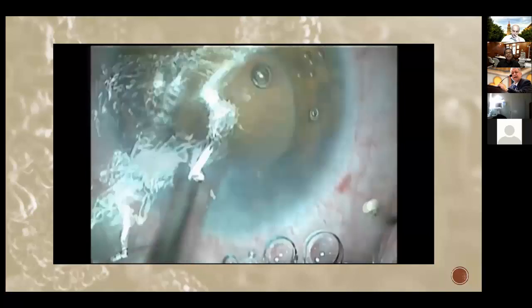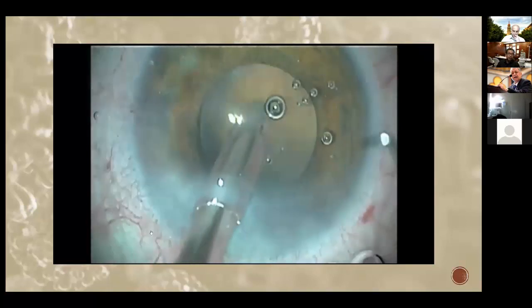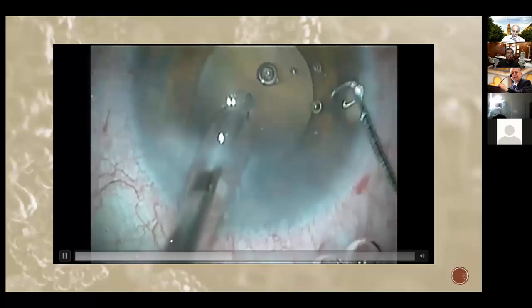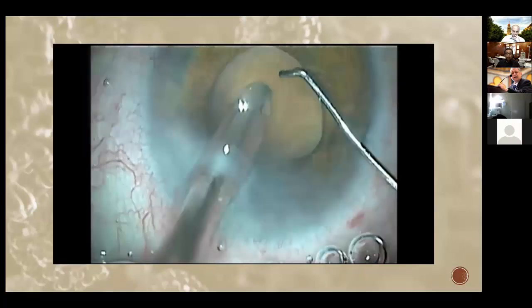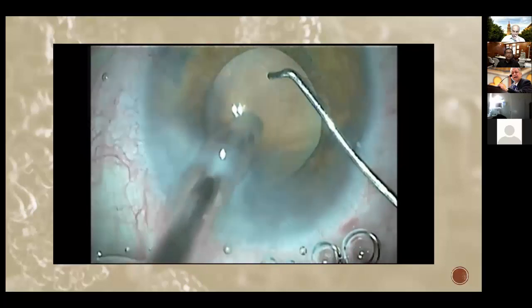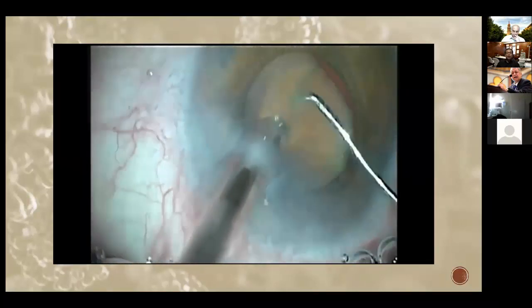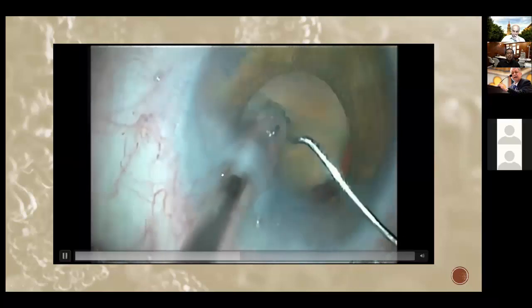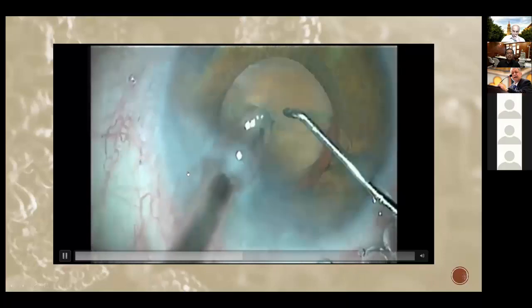Now my settings are going to change from a normal hard phaco case. What I will do is horizontal chopping, or transverse chopping, but I'm very scared. I don't know the thickness of the nucleus. So I'm trying to appreciate how thick the nucleus is.